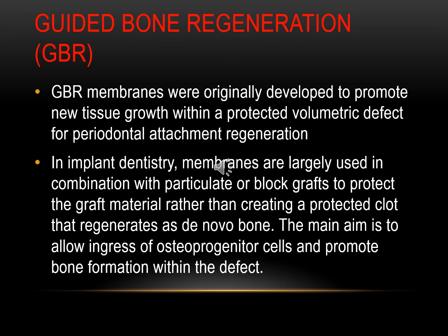Guided bone regeneration, GBR. What is the principle of GBR? If we have a bony defect and we use bone graft to fill this bony defect, after that we make the closure of the wound and the suture.